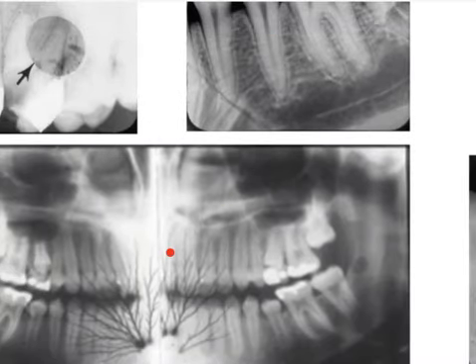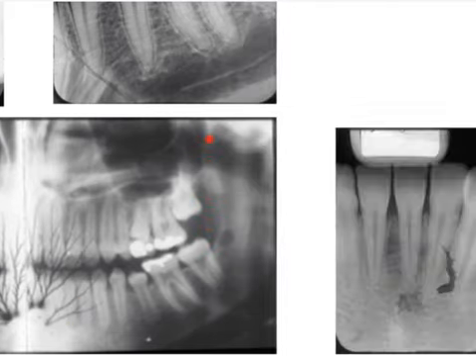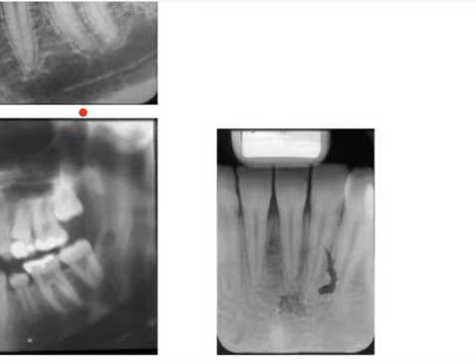Then what you see here is the static discharge. It looks like a leafless tree appearance. In intraorals also you can sometimes see static discharge. Now here you can see again a black or dark spot on the film, which can be due to dirty rollers in the automatic processing.